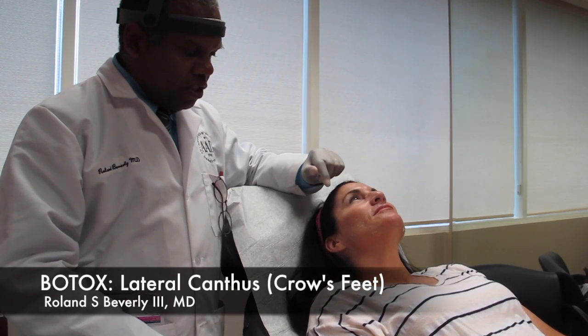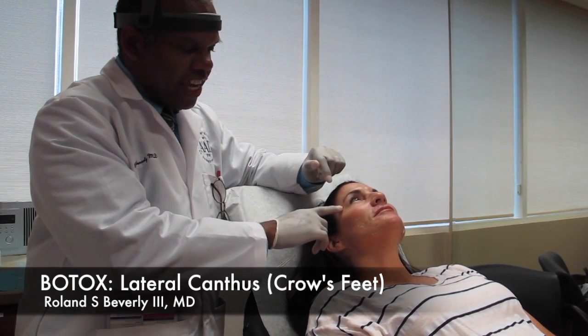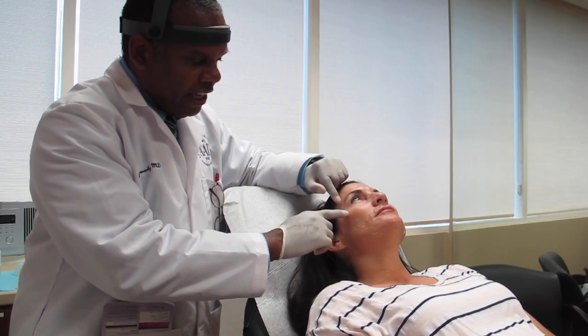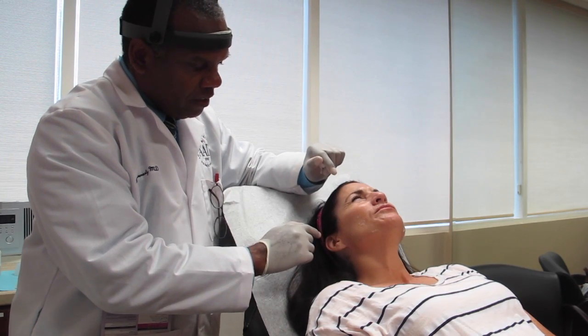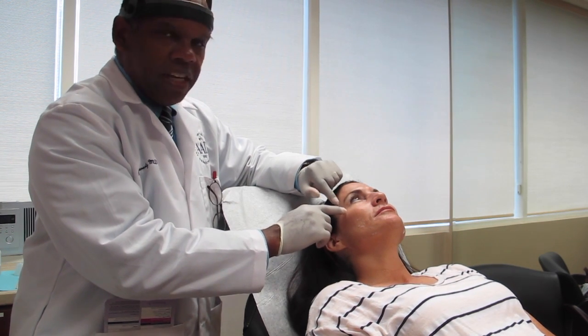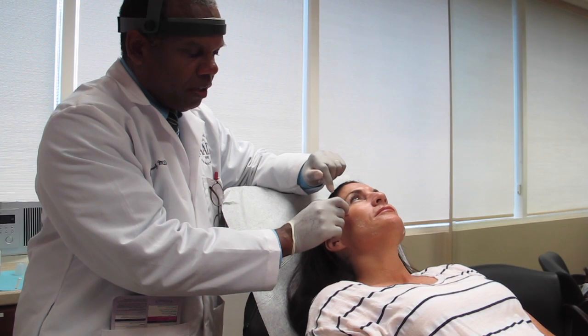Okay, well, now we're going to do around what we call the lateral canthus, what most refer to as the crow's feet. And this is a common area. Squint real hard for me. Yeah, you see, that movement is what makes that line develop, and what we do is prevent that from scrunching completely.